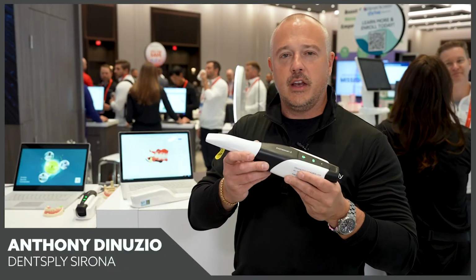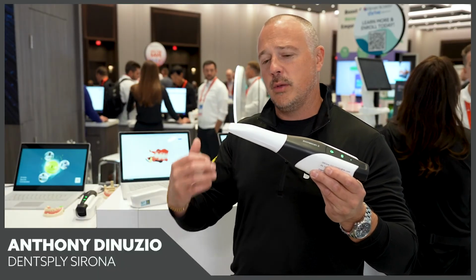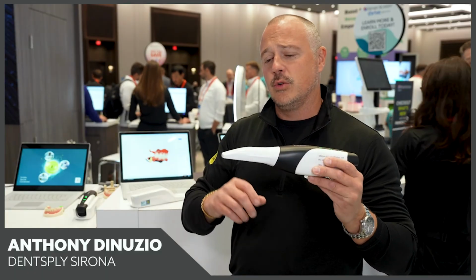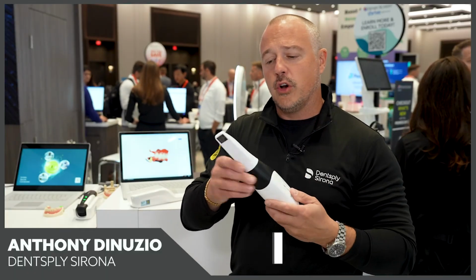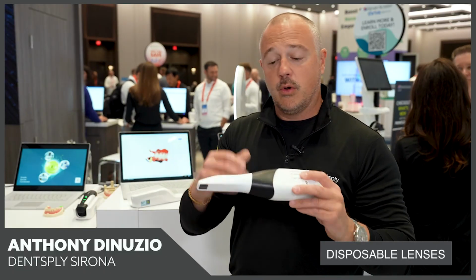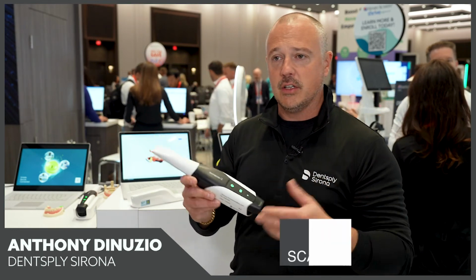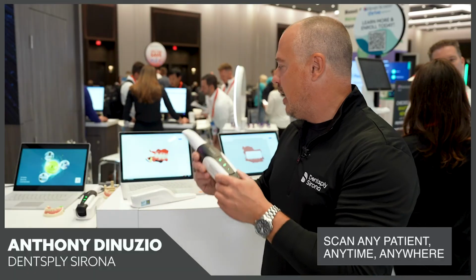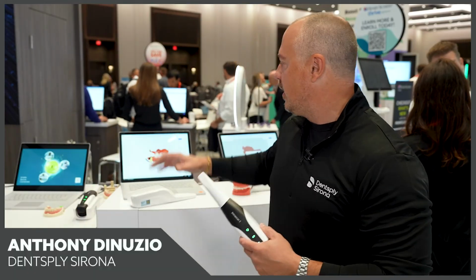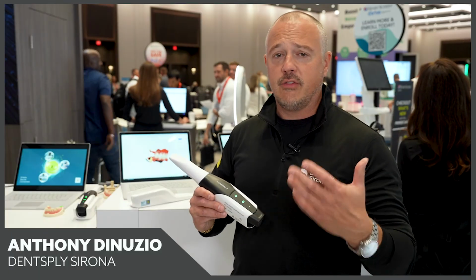What this gives us the ability to do is scan a lot easier in the back of the mouth. So scanning behind that terminal molar on a patient is a lot easier with Primescan 2 due to the shape of the tip. We also are using disposable lenses at this point, which just is a lot more hygienic when we're navigating within the operatory. And really the idea behind Primescan 2 is we can scan every patient. So as soon as I'm done scanning, I simply clean the camera, pass it on to the next user, and now I can continue everything that I want to do for that patient directly in DS Core, really enabling us to execute on that scan every patient concept.